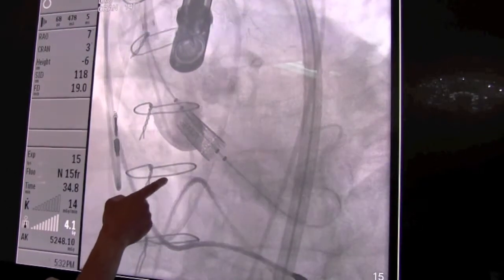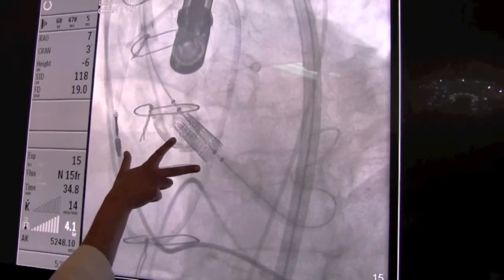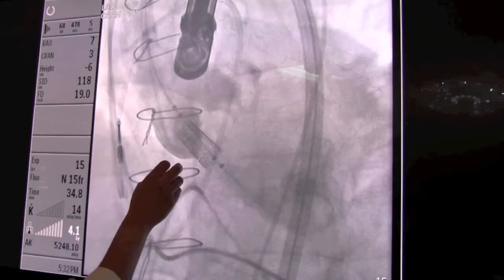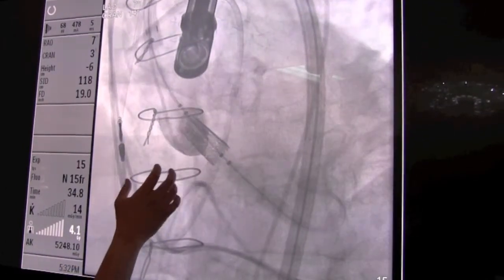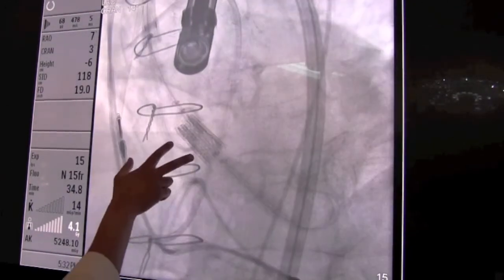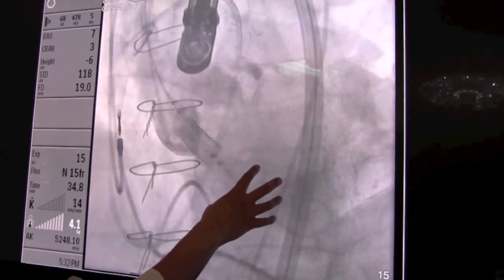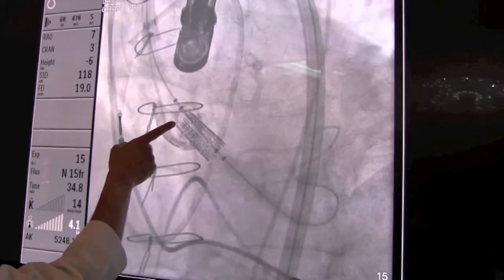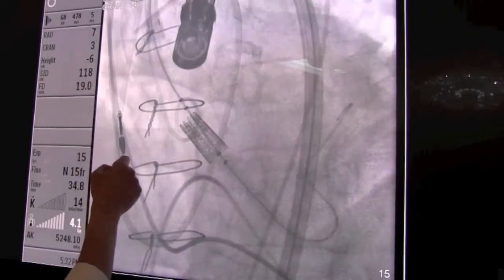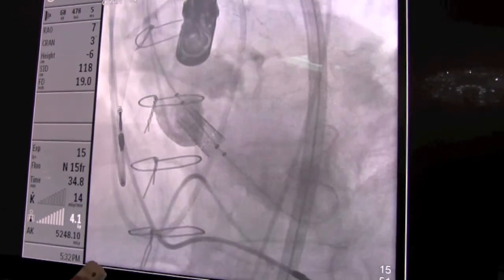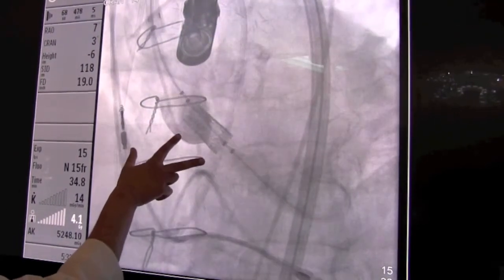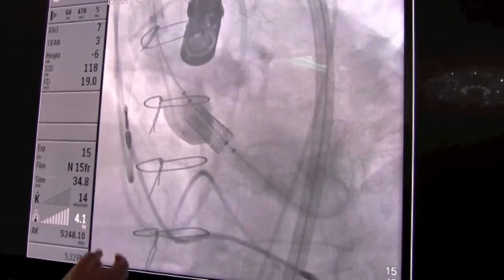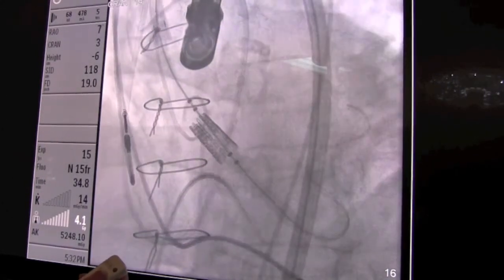In this picture we're trying to position the valve very carefully so it's right in the appropriate place. When we go to inflate it with the balloon it must end up in the correct position — if it goes too low it could end up in the patient's ventricle, the pumping chamber, which would be a disastrous complication; or if it's too high it could go into the aorta, also a very serious complication. So we spend a lot of time looking at positioning the valve correctly both by fluoroscopic imaging and via the transesophageal echocardiography probe.